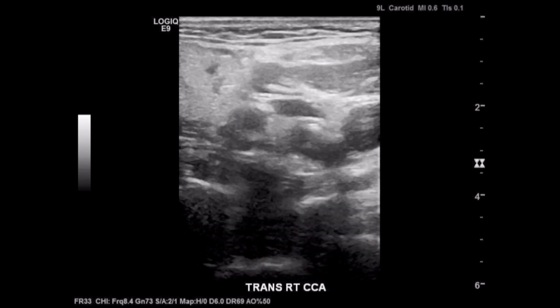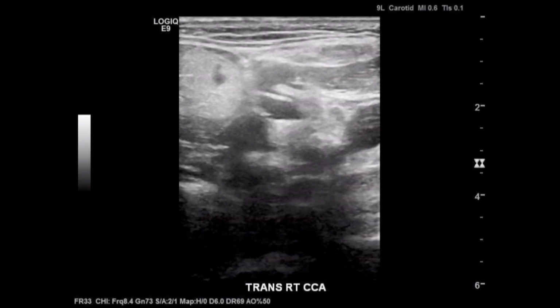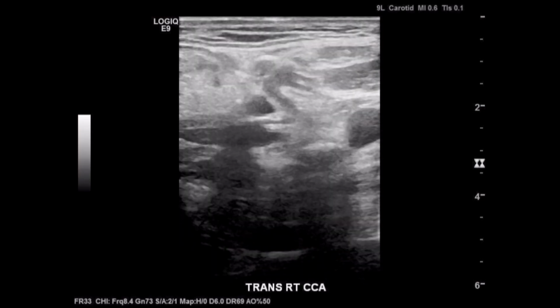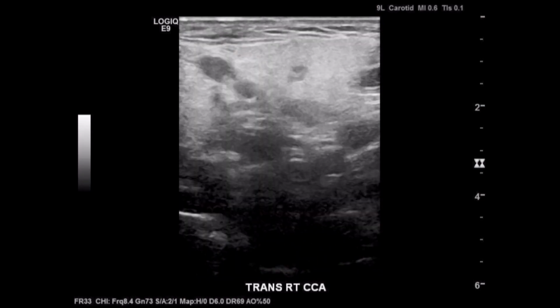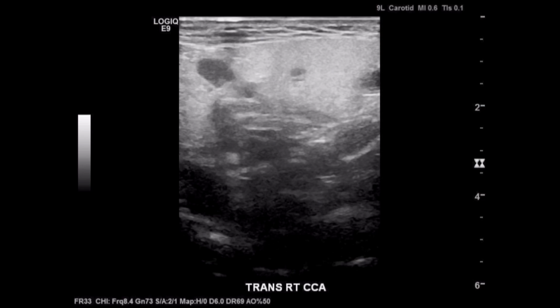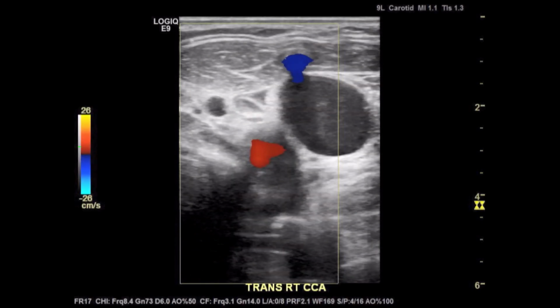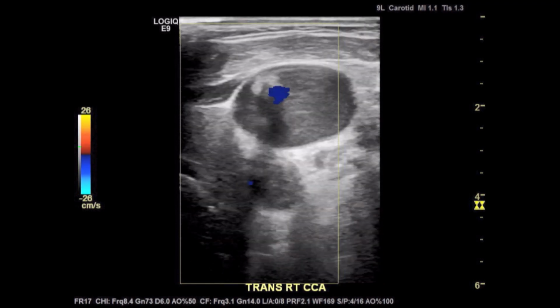Let's play it. Oh, this is so much better. So at the beginning of the clip, you see those. That's the dissection that we see going to the carotid and going to the subclavian as well, from the innominate artery. And after a nice grayscale, hopefully we'll get some color box. And the color box shows the flow. Hopefully that's the true lumen.